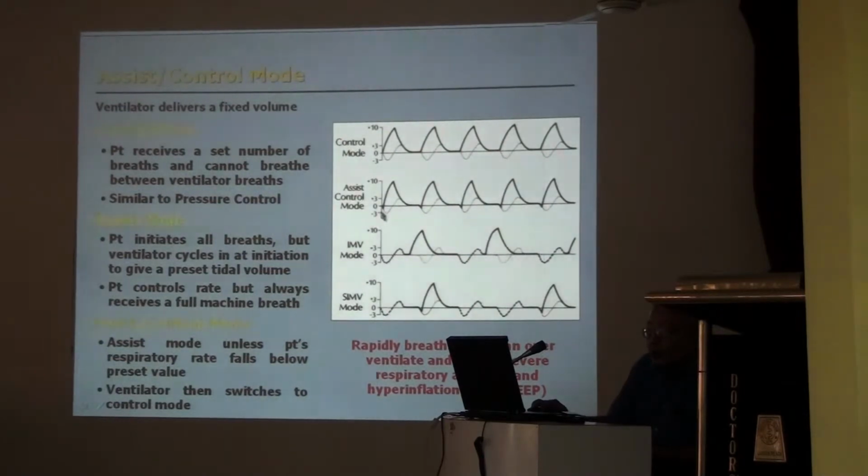Assist control mode. See, there is a notch. The machine is started by the patient's inspiratory effort. It is of course pressure triggering. It starts at, say, -3, or even 0.5 centimeter. Even a 0.5 centimeter change can be sensed, and the slightest flicker from the patient will initiate the machine's inspiratory phase. Then come other parameters, which I skipped very rapidly in the slide.